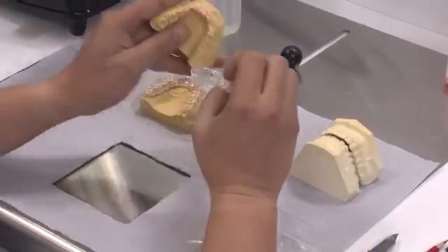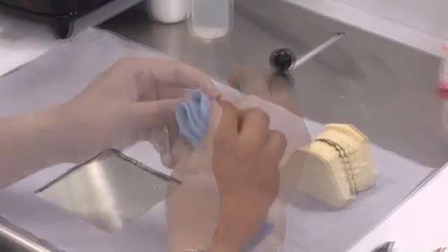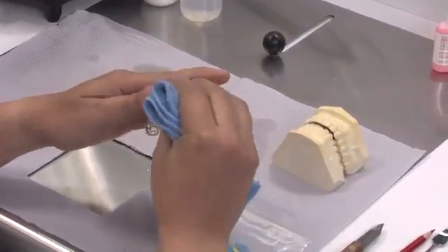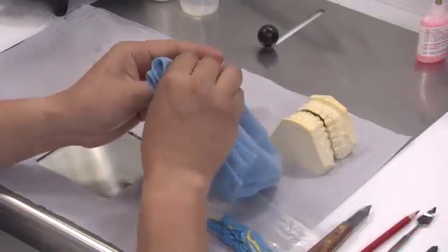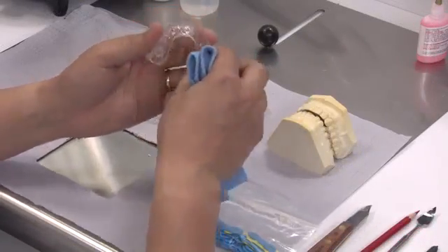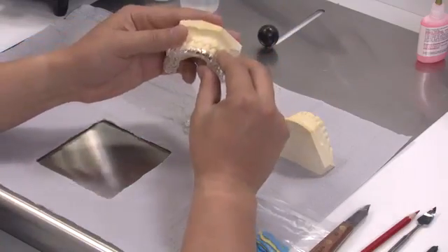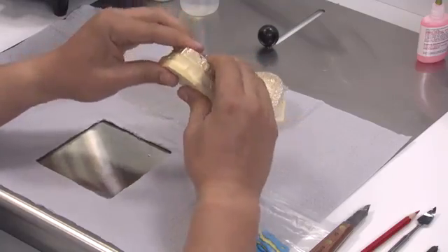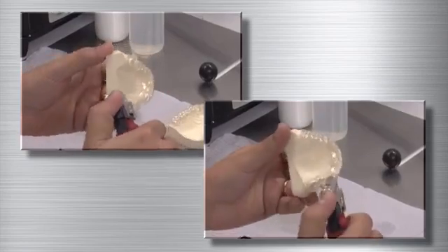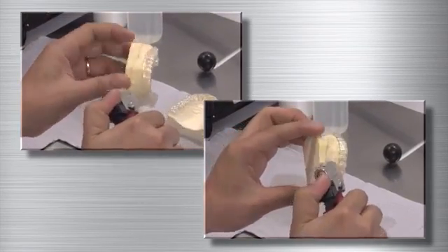Take the trays off of the duplicate models. Dry the inside and outside of the trays using a clean cloth towel. Place the trays on the master models. Inspect the trays for fit. Using a small torch, quickly run the flame over the trays to create a high gloss finish.